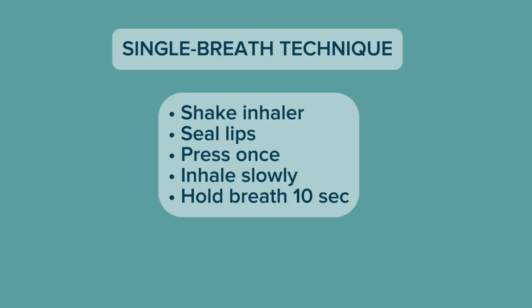Are you ready? Exhale. Now immediately grab the mouthpiece with your lips and teeth. Make sure to form a tight seal. Okay. Now I'm going to depress the canister. Breathe in. 1, 2, 3. Hold your breath for 10 seconds. 10, 9, 8, 7, 6, 5, 4, 3, 2, 1. I will remove the spacer chamber. You can breathe now. Are you alright?